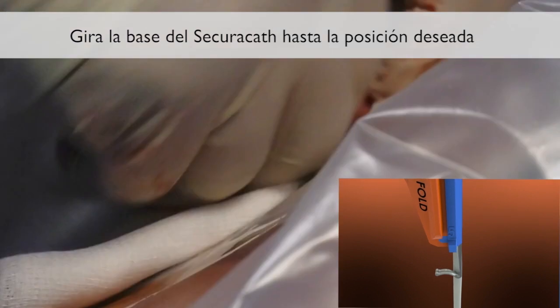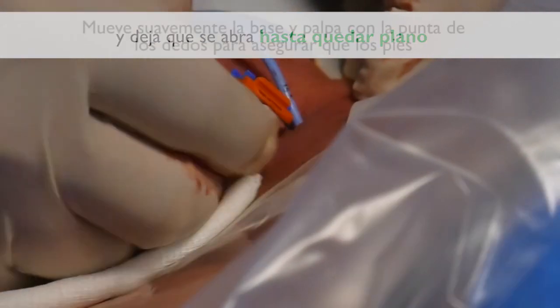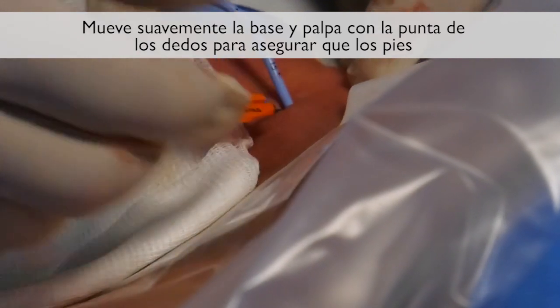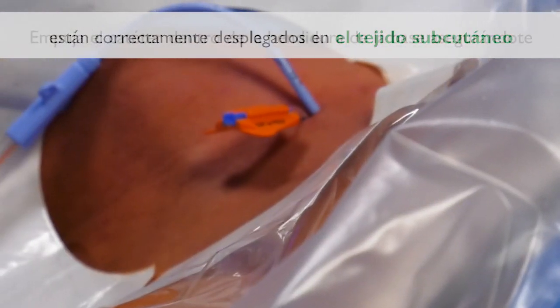Turn the SecuraCath base to the desired indwelling orientation, then release it, allowing it to open until flat. Gently pull on the base and palpate with fingertips to be sure the feet are properly deployed in the subcutaneous tissue.